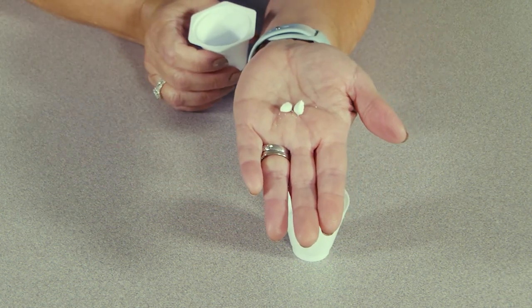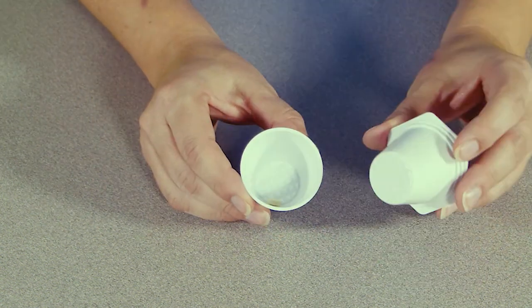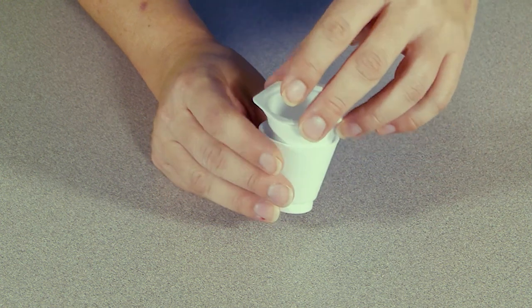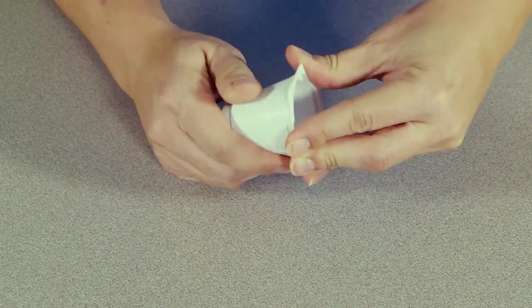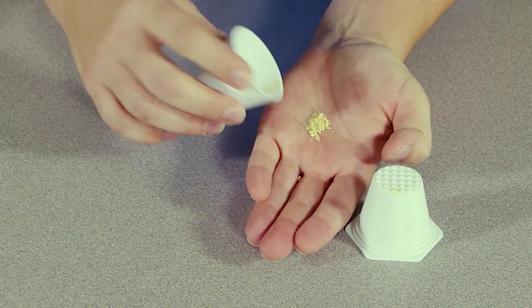Crushing is just as easy. I drop the tablet into the bottom cup, which is grooved for even crushing, and then place the top cup inside. Twist the cups in opposite directions like this, and the tablet is now a fine powder.